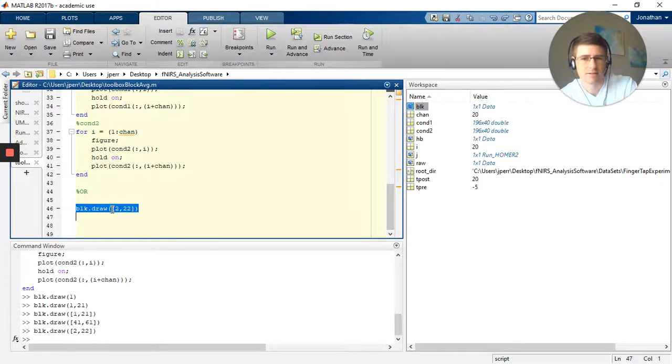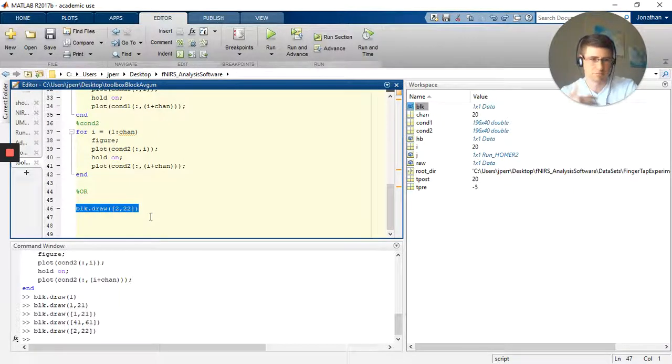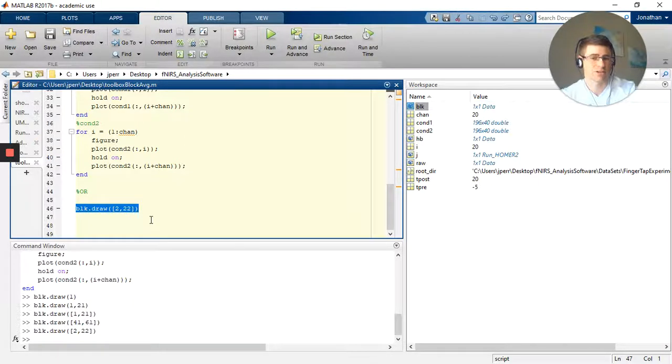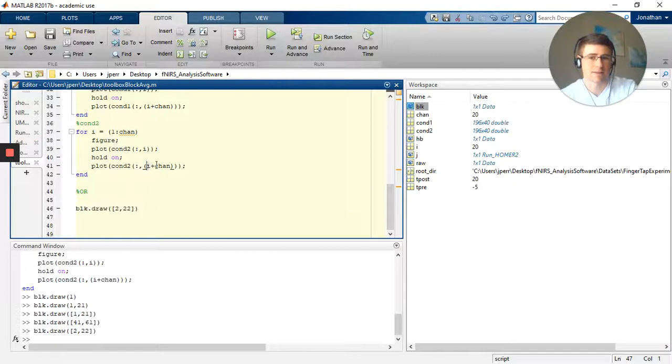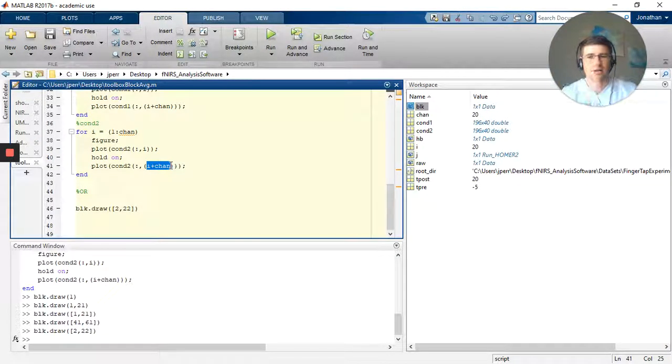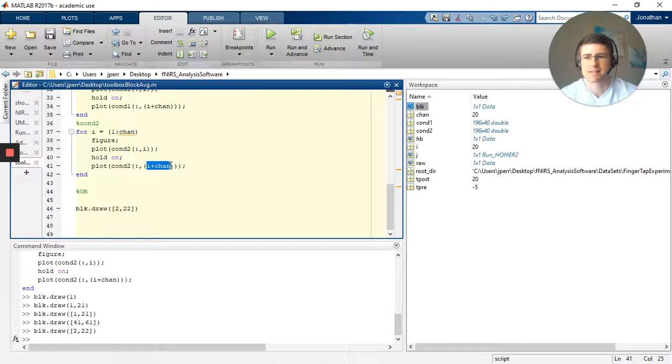However, this is really easy. You just do your block average dot draw and you select the channels you want. And again, you can do the block average, or excuse me, the for loops using the channel separation to pair off the oxy and deoxy.